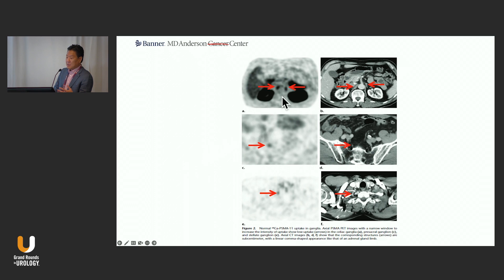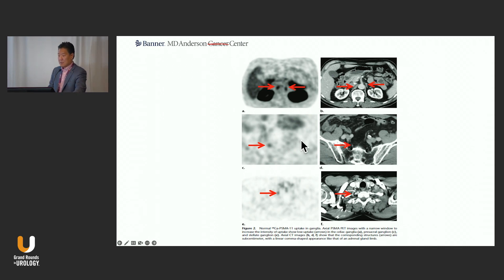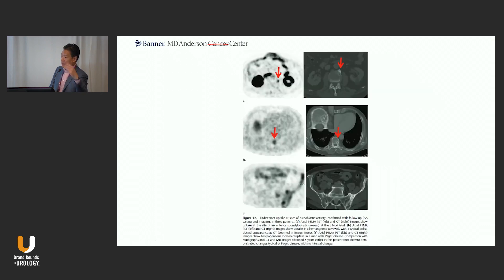This shows examples of ganglia — neural bundles that have uptake with PSMA PET. These are not metastatic lesions; these are just normal nerve bundles that have uptake. So it's something to be careful of. If you see something mentioned in the retroperitoneum or presacral area, take a look, question, challenge. It's a learning process for the radiologist and the urologist. Be aware of that type of pitfall.